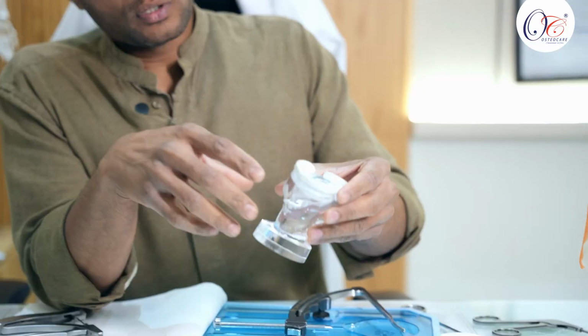Okay, so what are the main advantages of this particular RootFix anchor from OsteoCare? So the first important thing is we just drill a tunnel with a 2.3 mm drill bit. So the bone loss in the tibia will be minimal. Number 2, the suture threads are not in the tibial bone. They are actually fixed just beneath the root tear.